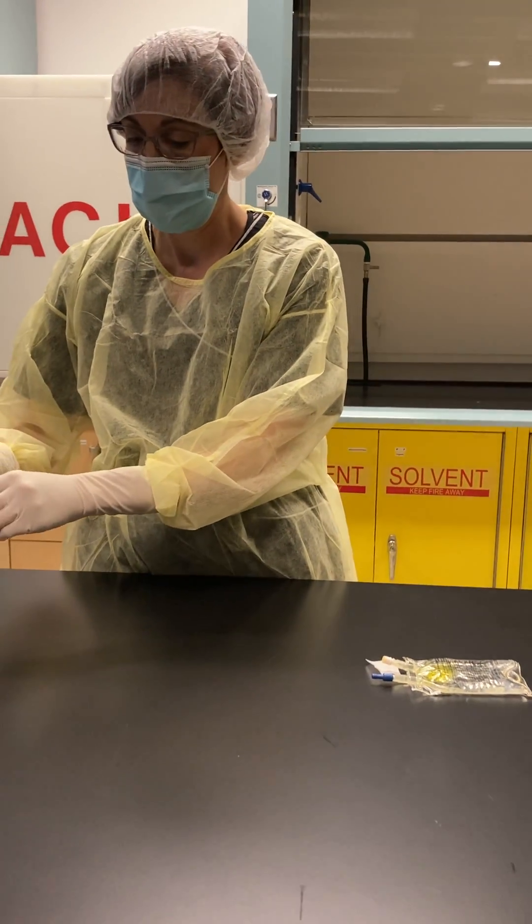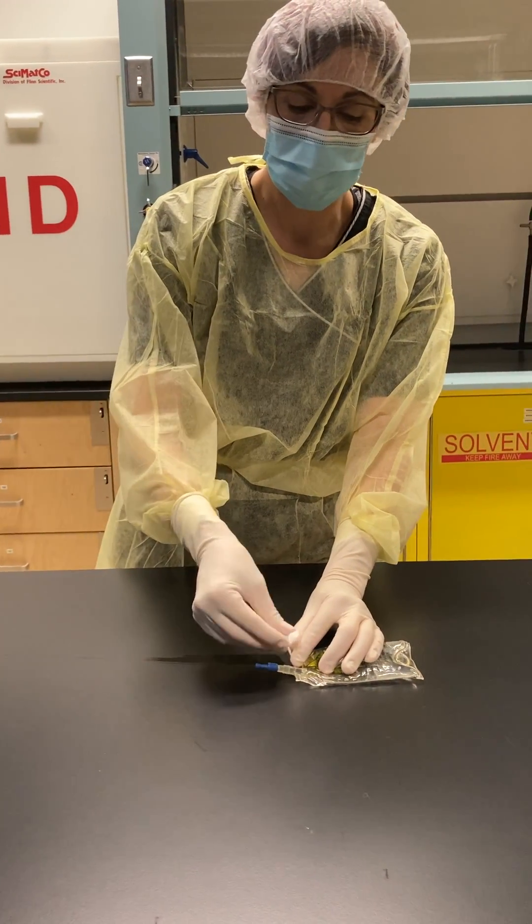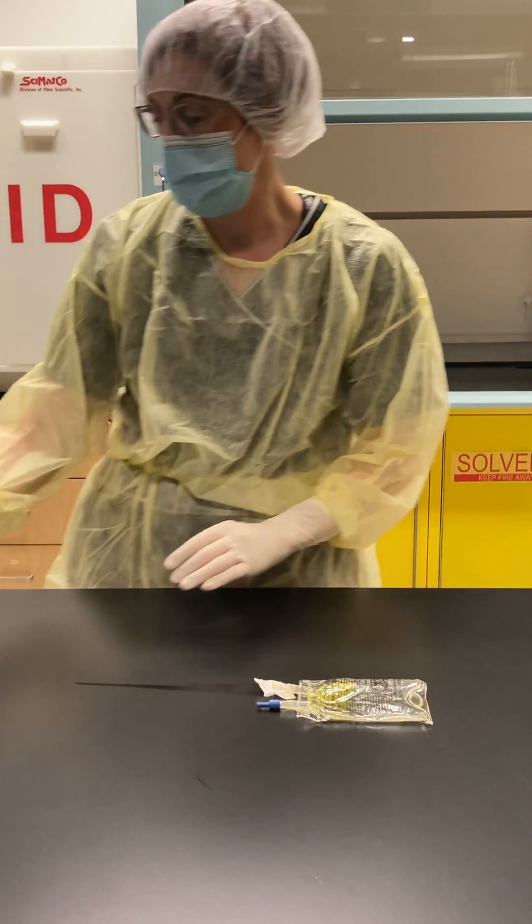I'm now going to, as I'm done, re-swab my medication bag port. And again, let it dry.